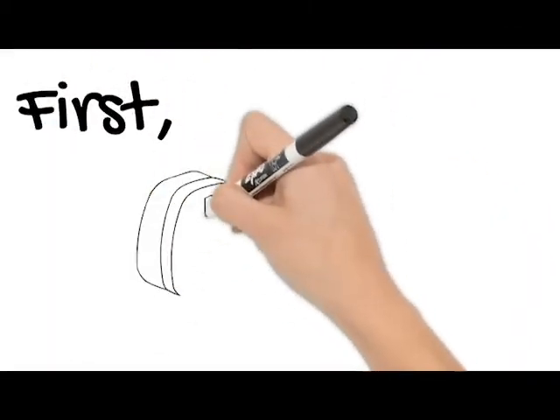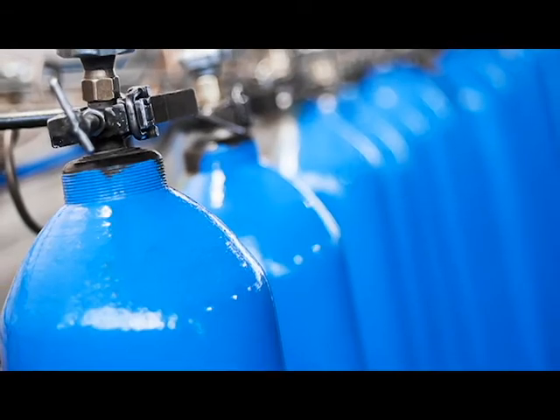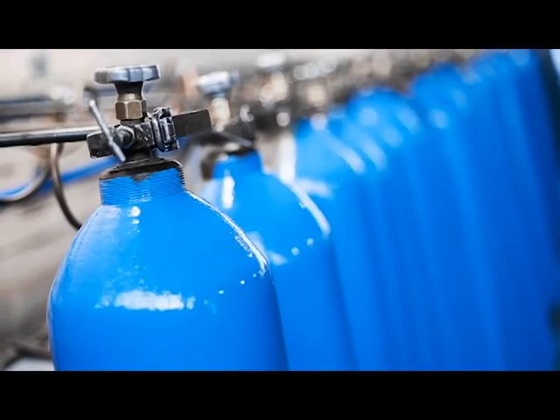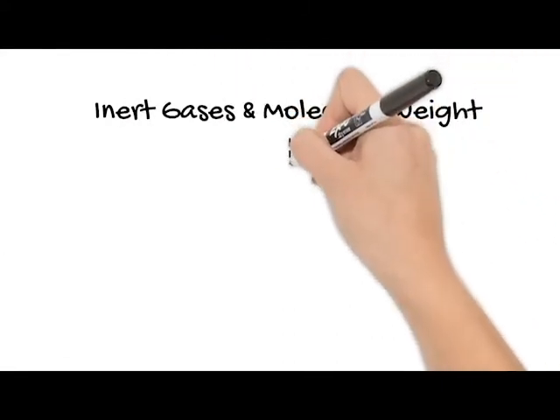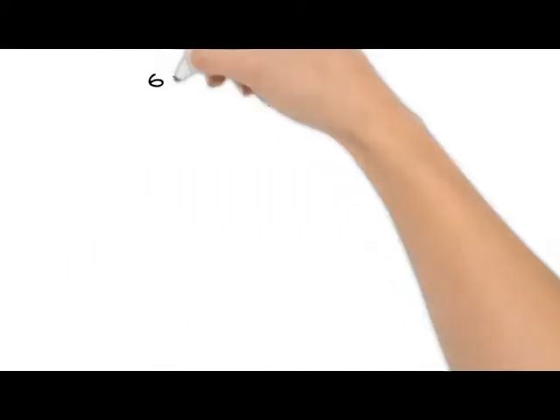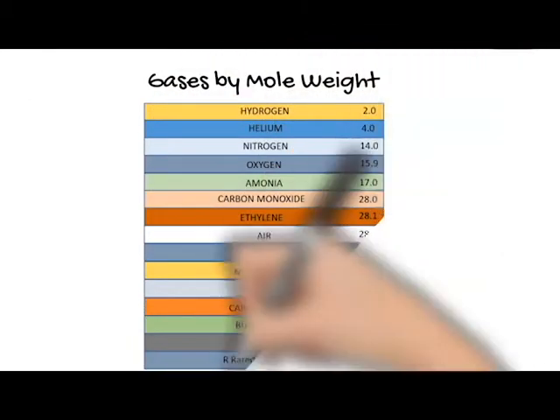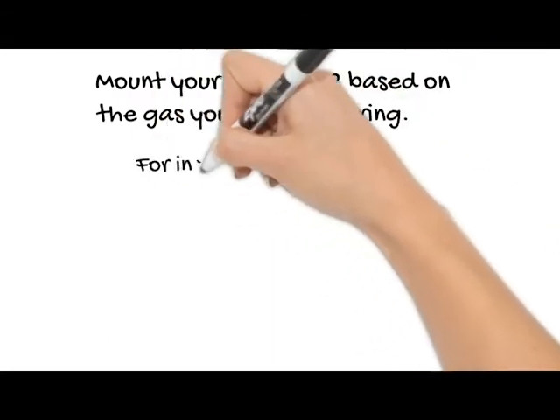First, choose a location near a wall outlet to install the main sensor unit. The main sensor unit is commonly mounted near pressurized tanks of liquid nitrogen or argon. Because inert gases vary in molecular weight, the oxygen depletion sensor will need to be mounted at the height associated with the gas that you are concerned about. This diagram demonstrates the various molecular weights and heights associated with inert gases.